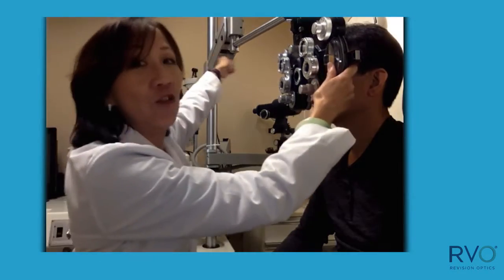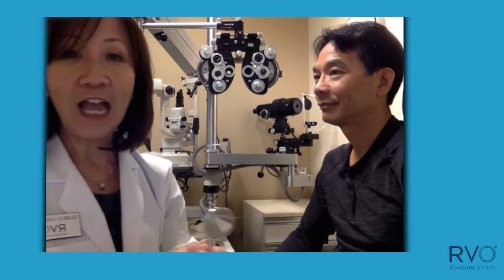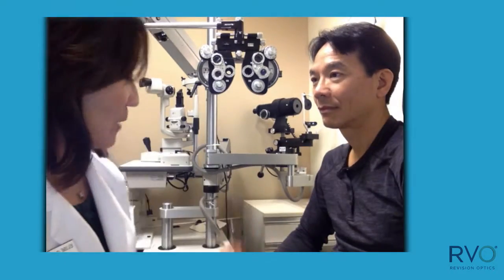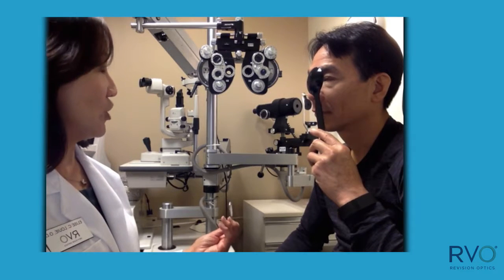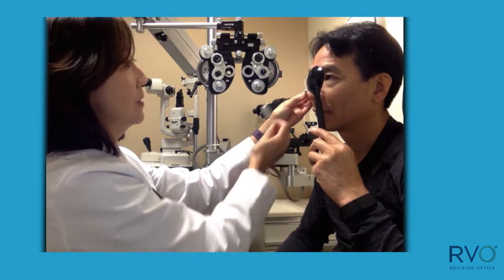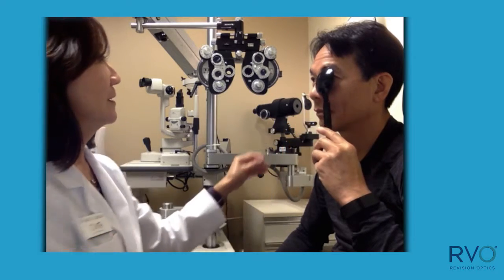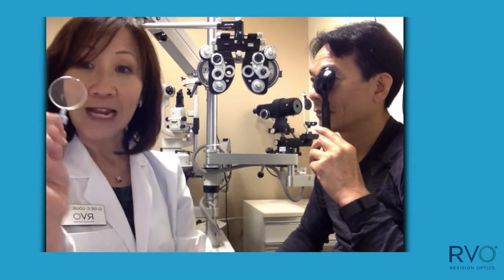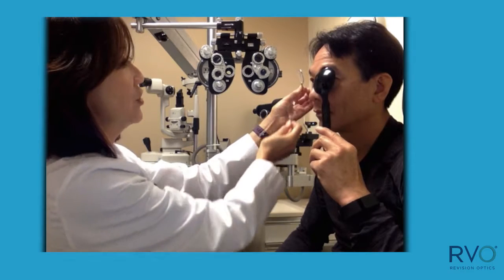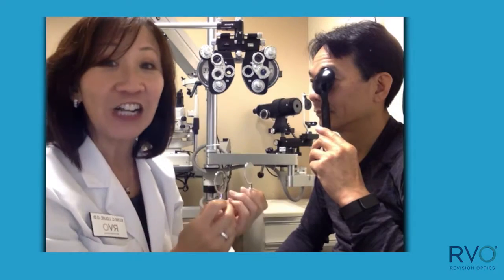So remove the phoropter and verify in free space. Here I have some trial lenses — a minus one and a plus one. When you put them together, it makes plano. So if you can please cover your dominant eye, I'm going to give you three choices — tell me which is clearer. Choice one, choice two, or three? Three. Get a much cleaner endpoint in free space.